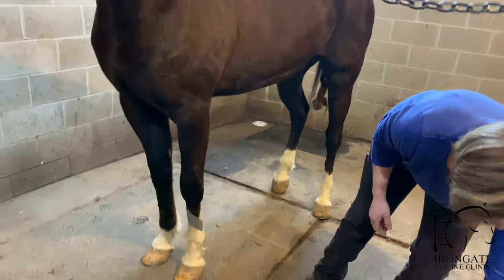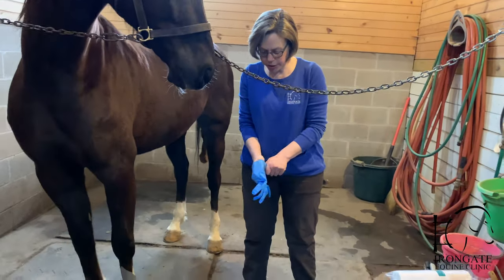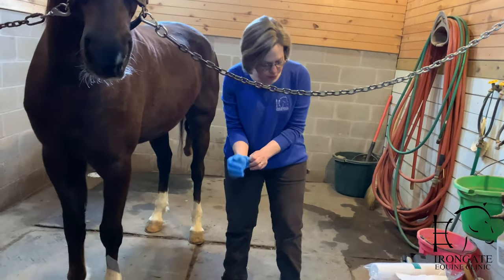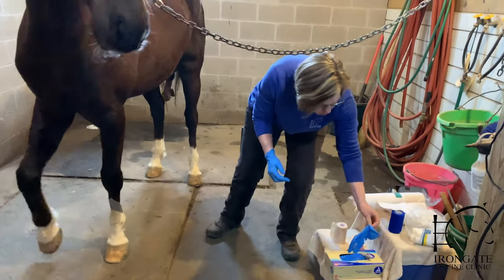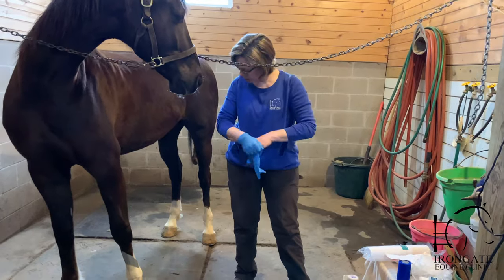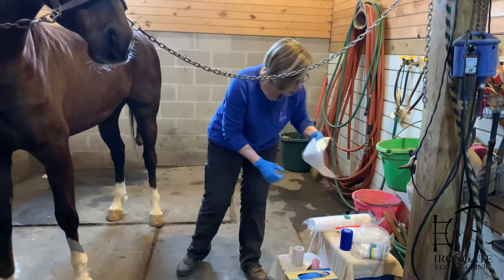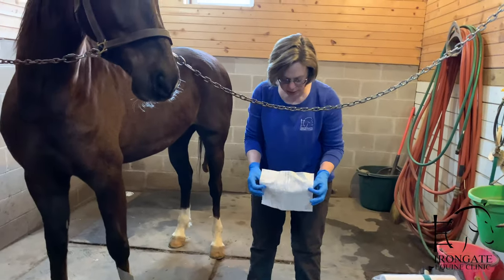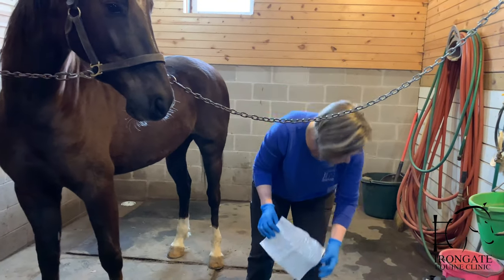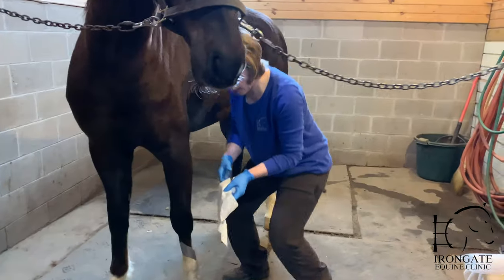You'll want to follow your veterinarian's instructions, but in general, I would have you wear gloves while you're handling the wound. These don't need to be sterile, just exam gloves. And then we usually start with a non-stick pad — this is a large telfa pad, similar to what you would have on a bandaid, so that it doesn't stick to the wound.